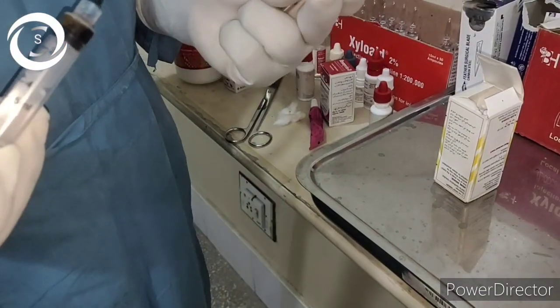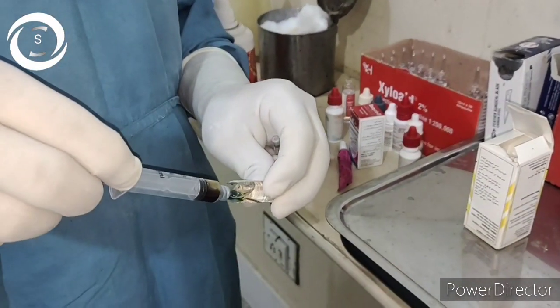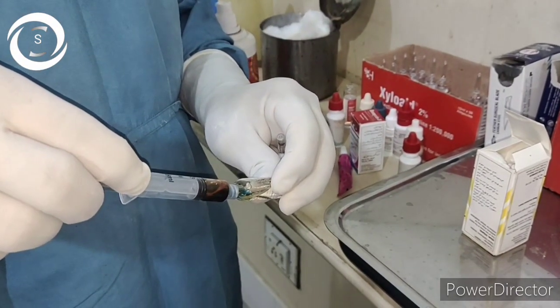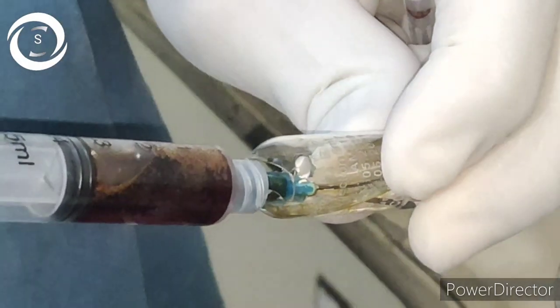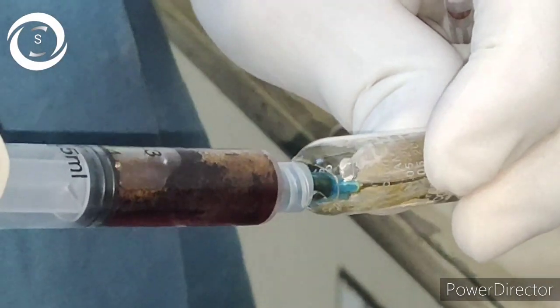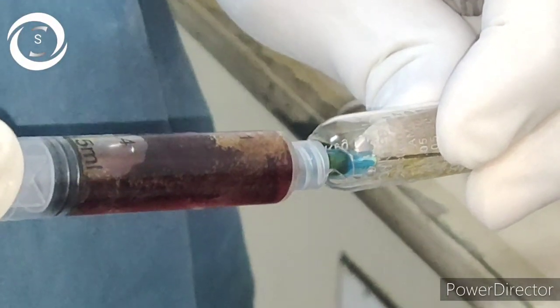Now, intravitreal injections can be performed in office as well as in operation theatre. Studies say that chances of endophthalmitis are less while performing it in operation theatre. So I prefer OT instead of office.